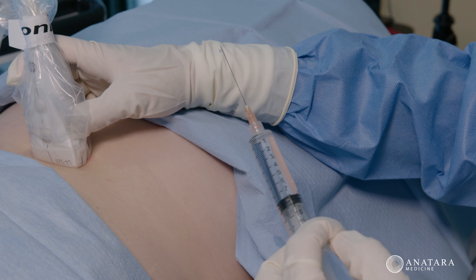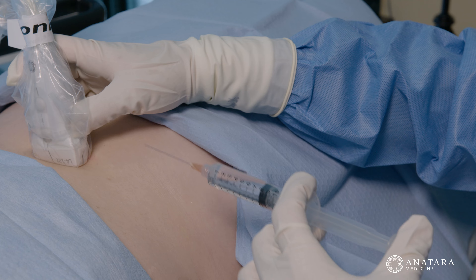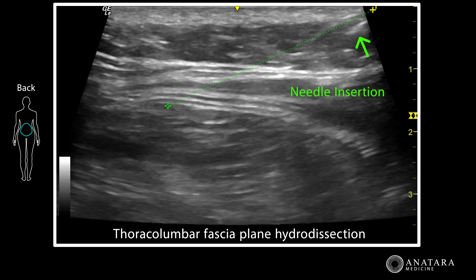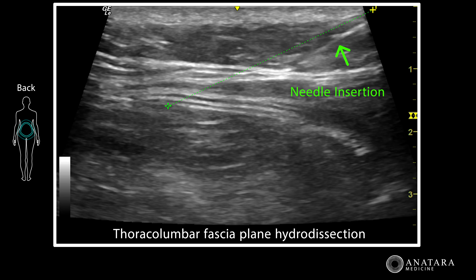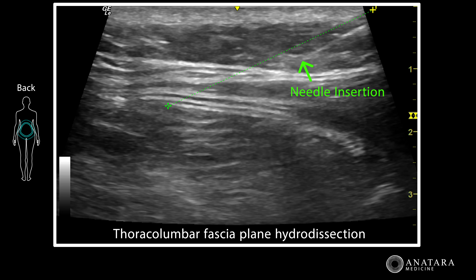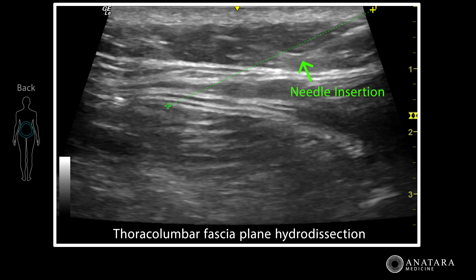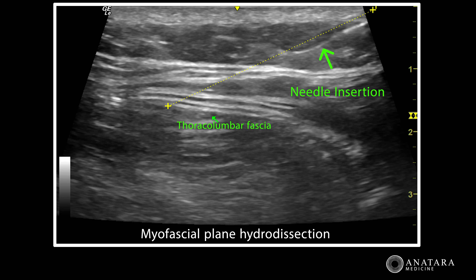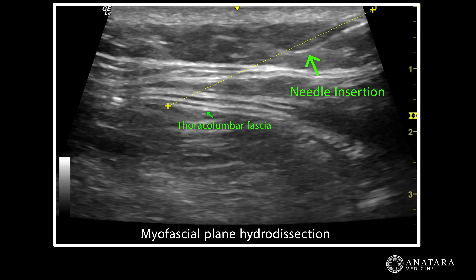Right now we're using ultrasound to guide a needle into the connective tissue layer in the lower back that often is a choke point for many nerves that travel through there, and can often become adhesed due to scar tissue or trauma. You can now see that the needle is being passed in a directed approach above and below the thoracolumbar fascia.